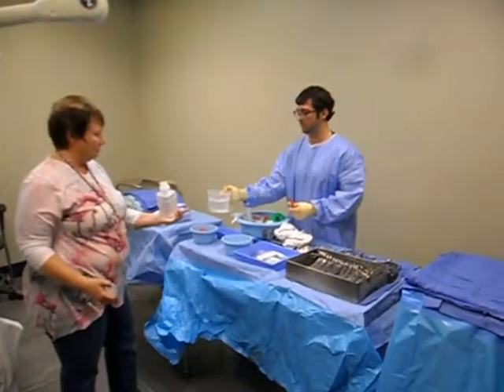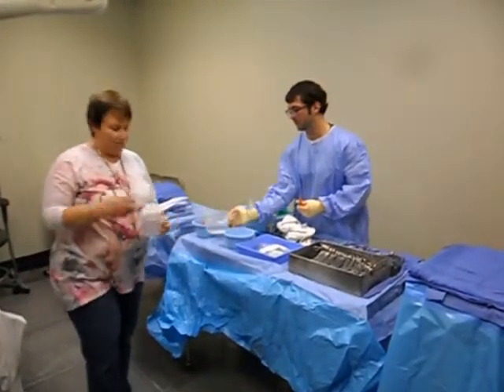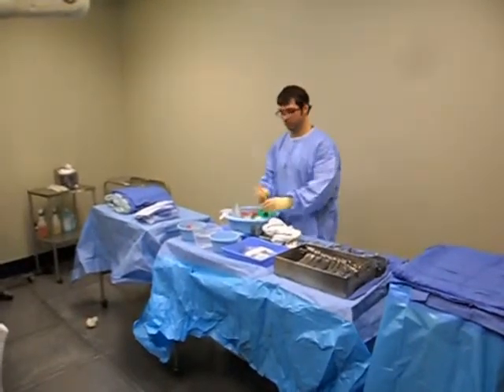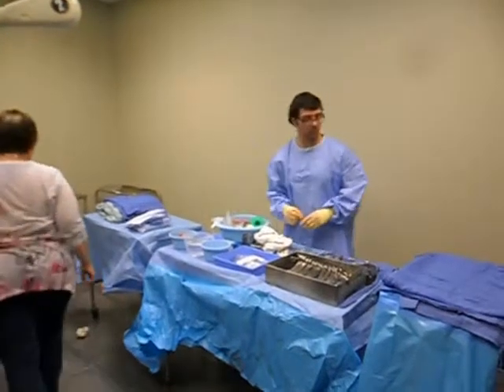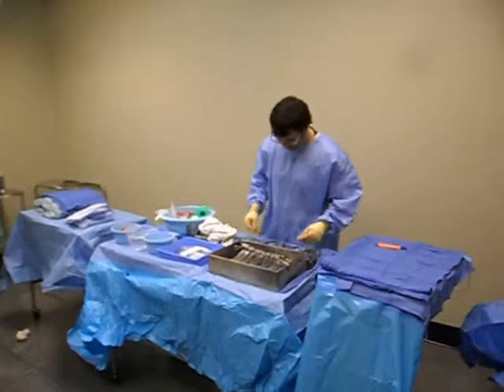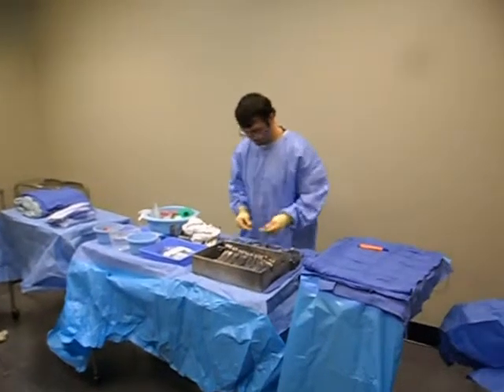Sailing, October 2015. Okay, 500 mils. 500 milliliters. Okay, you labeled that, all right. Calibrations. Put it on here. At this point, I would put a blade on my. Okay, put the one up that has it on there. Okay.